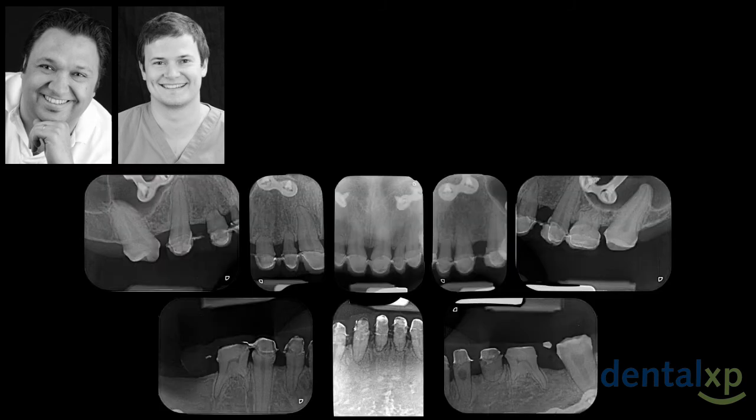As you can see, she's got multiple failing temporary teeth associated with severe bone atrophy in the maxilla and in the mandible, so implants are clearly not possible without preliminary bone grafting. You can also see that we got some issues with the orthodontic treatment because space management was not so correct. So this is a real challenging case with a very sweet young lady, but she's also traumatized by all her previous dental treatment. So she's really not a piece of cake. She's a tough cookie, and she's really not easy to manage.